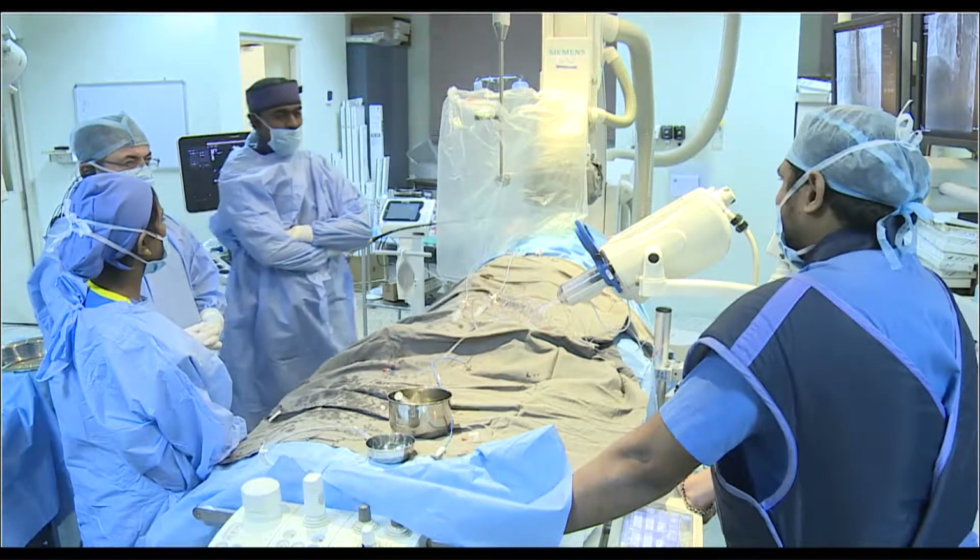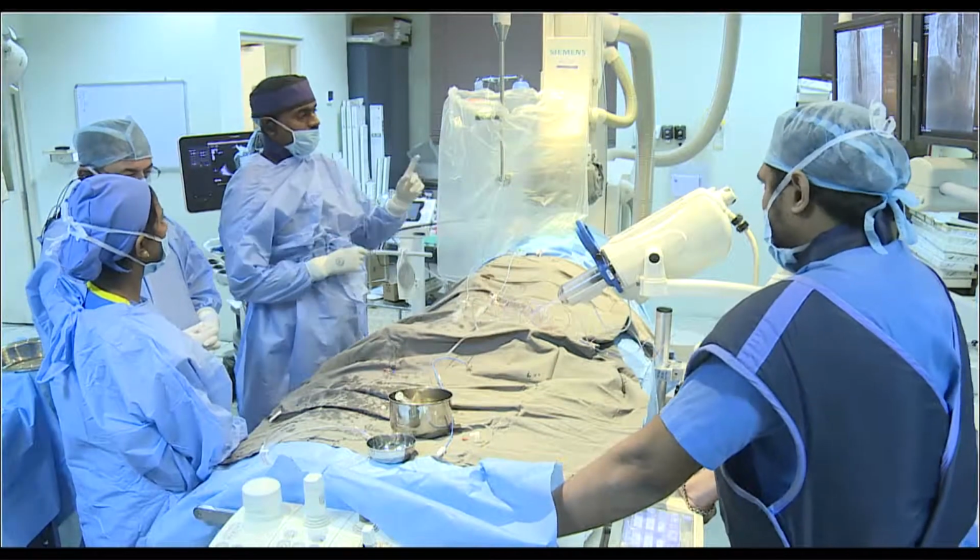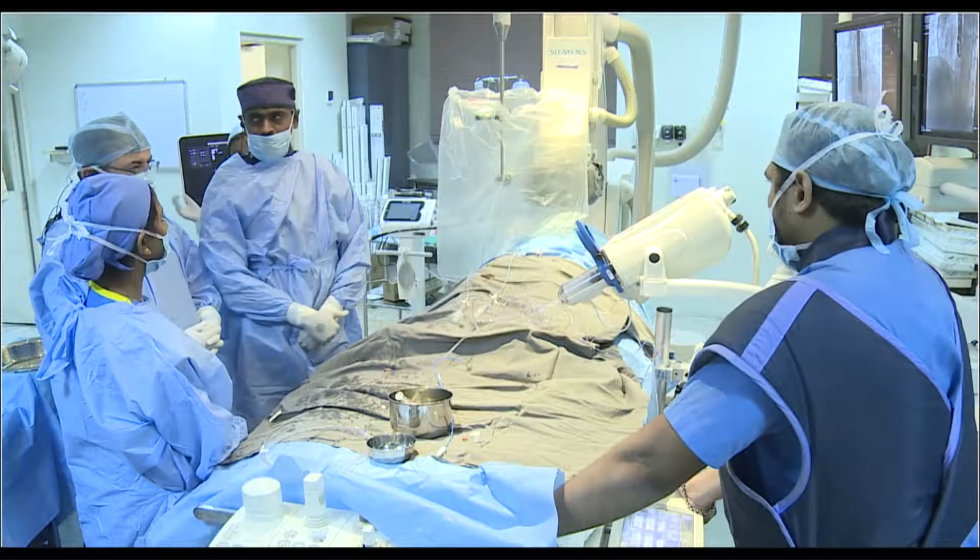We want to show a new device, the multifunction occluder. So, can you quickly get on to the PowerPoint presentation, Ronak?